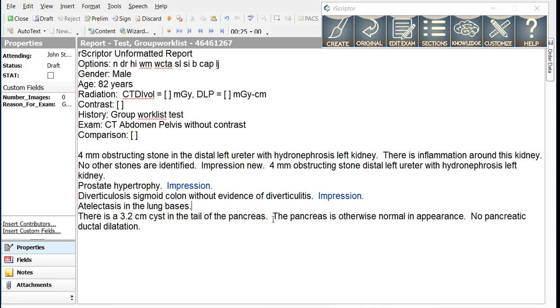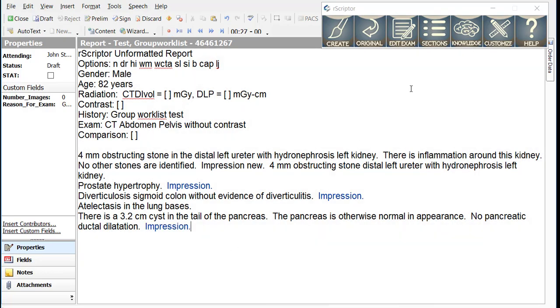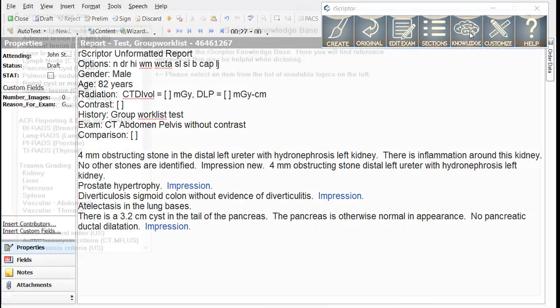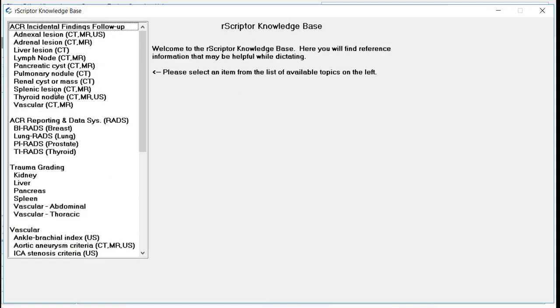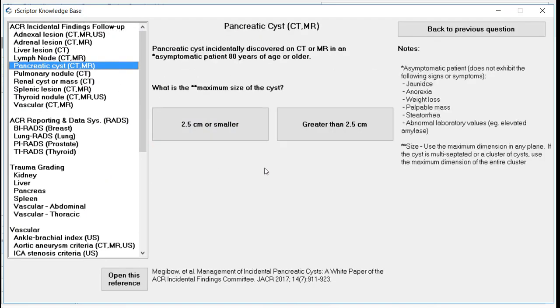And then finally, we have the pancreatic cyst finding, and we want to add to that the follow-up recommendations for the pancreatic cyst. Impression period. And again, we can use the knowledge base to help us put in the appropriate recommendation.